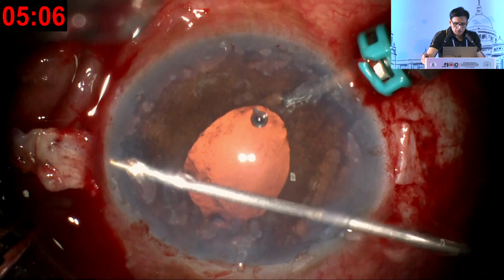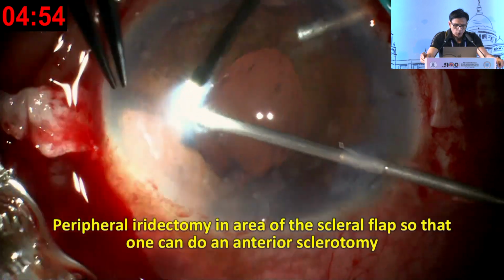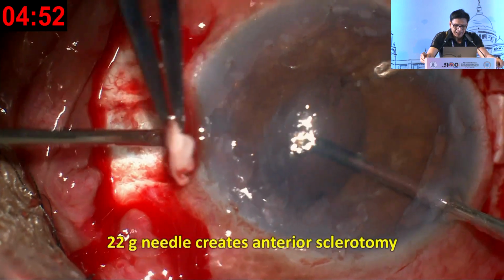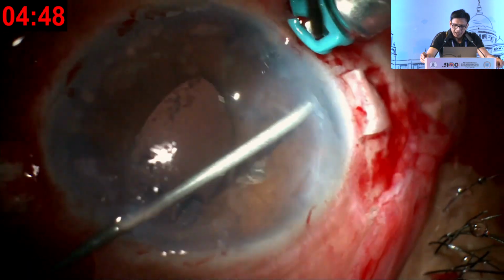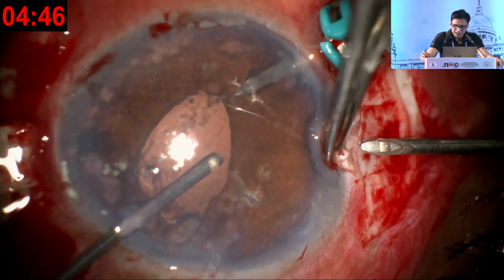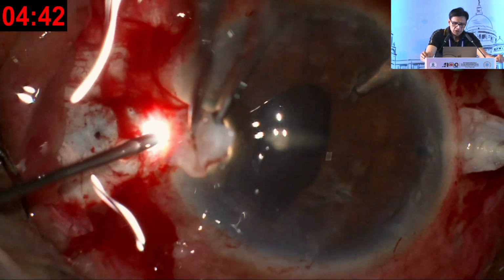Now once I've done that, simple trick, when you have large eyes like this, that's a large white to white more than 11, make a small peripheral iridectomy in the area of the scleral flaps. You can see I've done one on one side. This way I can come more anterior and go through the iris, through the iridectomy. Here on the other side also I've done, and you can see there I made my 22 gauge sclerotomy.